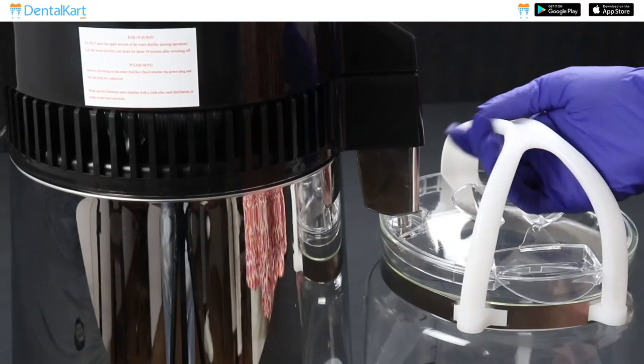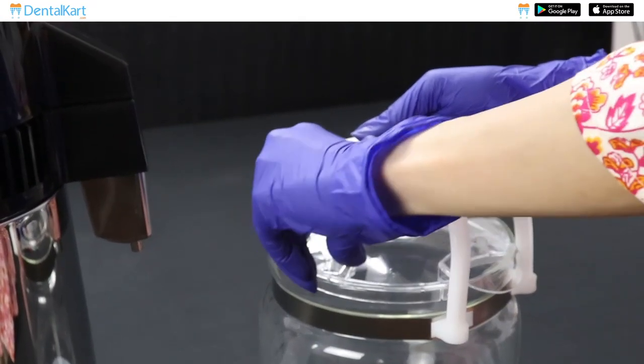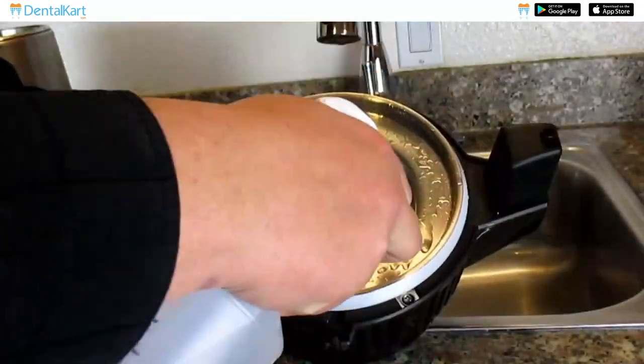Once the distillation process is complete, carefully remove the collection container and store the distilled water in clean covered containers. After use, clean and descale the distiller.